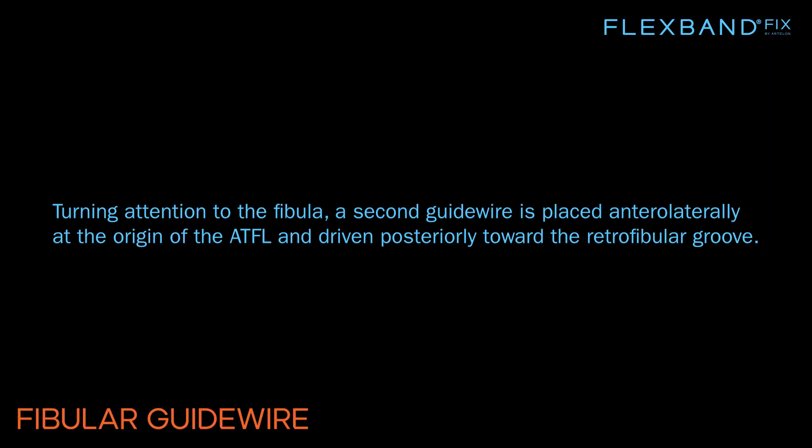Turning attention to the fibula, a second guide wire is placed anterolaterally at the origin of the ATFL and driven posteriorly toward the retrofibular groove.